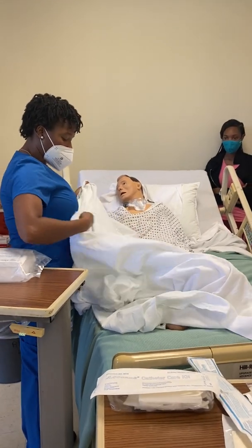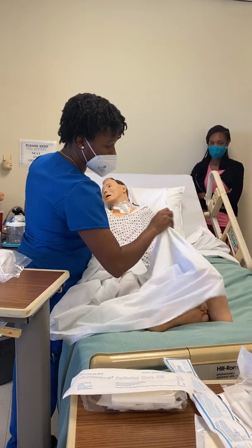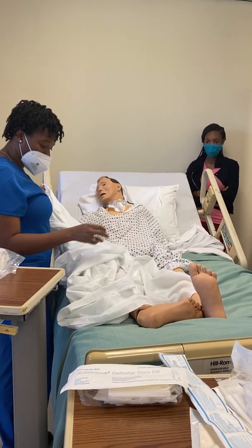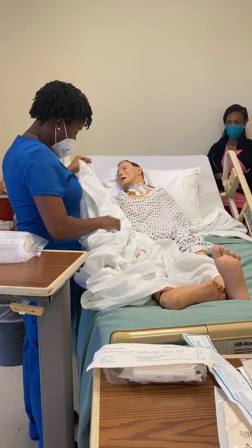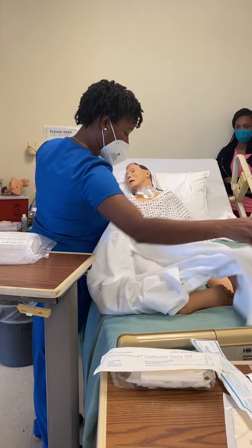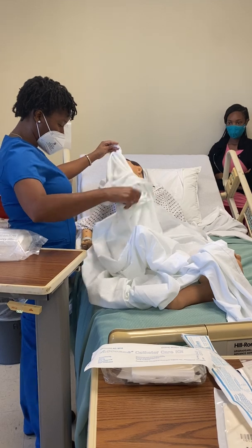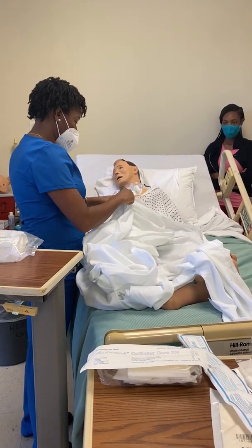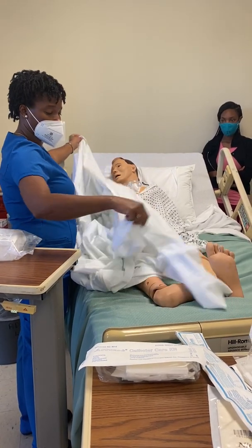There's another drape on the inside that I'm gonna tell you the same thing about. Some instructors want you to use it. Some instructors don't make you use it. And we do that because it's not really required in the hospital setting. So most rooms that you use now are semi-private. So the purpose of the drape was kind of to give you some privacy. But if it's a semi-private room, what can you do? Curtain. Just pull the curtain. And that still gives that patient all that privacy.